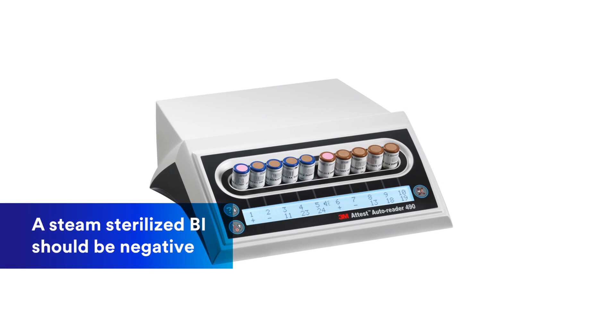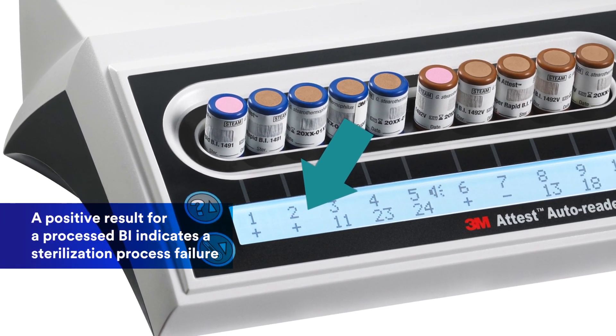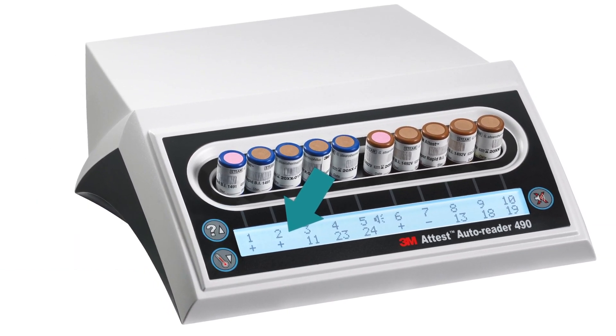A BI from a PCD that is exposed to a steam sterilization process should be negative. A positive result for a processed BI indicates a sterilization process failure. The sterilizer should be taken out of service, an investigation initiated, and the load reprocessed.